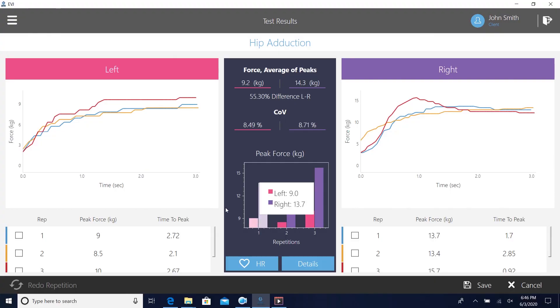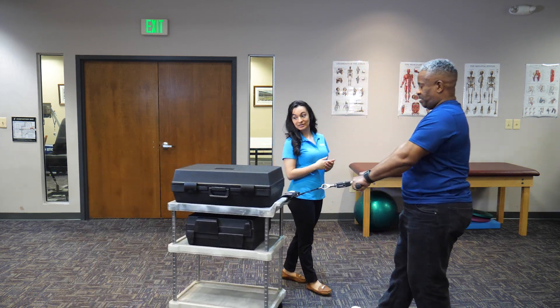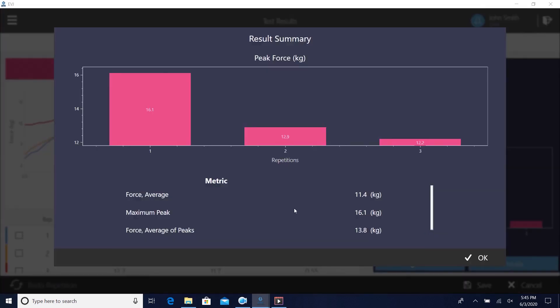The streamlined reports let you compare data from both the right and left sides. The EVJ doesn't just measure isolated movements. You can also test full functional activities like pushing or pulling a cart while also measuring heart rate for exertion and safety. Whatever the movement, the EVJ's instrumentation helps you measure it precisely and easily.